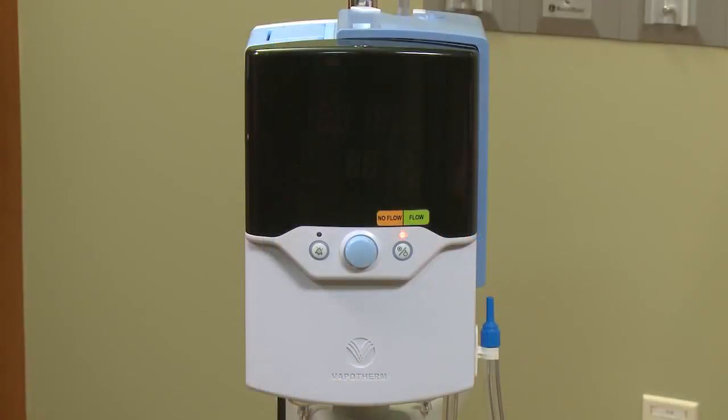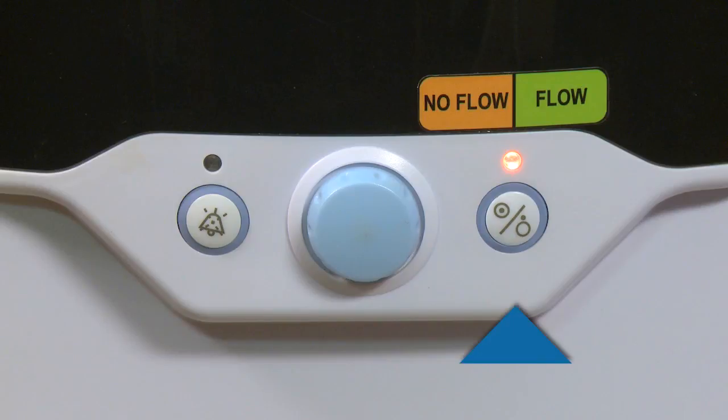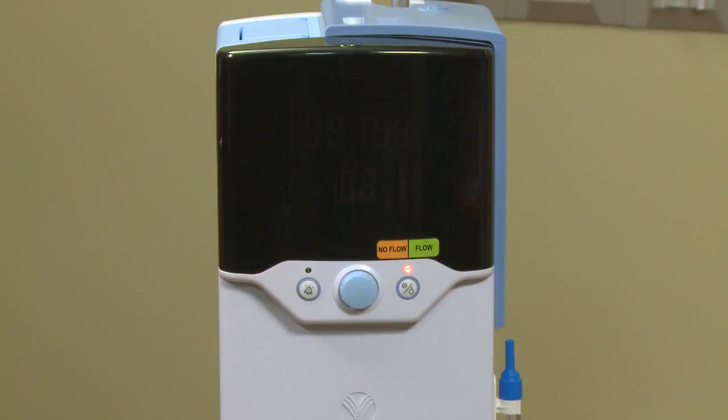To turn on the Precision Flow, locate the three controls on the front of the unit. The Run Standby button powers the unit on and also places it in standby. The Setting Control knob allows you to adjust the parameters, and the Alarm Mute button will intermittently silence alarms and also dim the display panel. There are three modes: Sleep, Standby, and Run. The screen is currently blank with an amber light showing, indicating it is in sleep mode. The unit cannot be started from sleep.